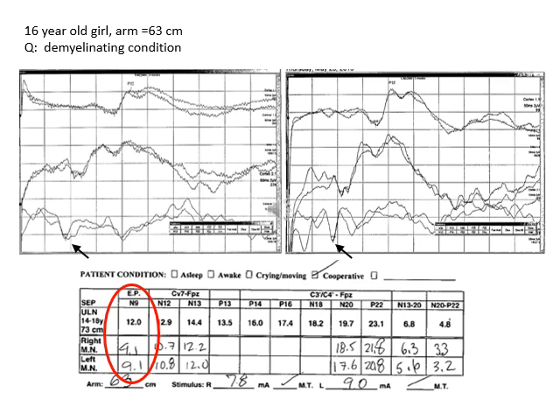And then when we look at the bottom, we'll see that the technologist has written in the latency values, which are 9.1 for both the left and right arms, and the upper limit of normal is 12. So the Erb's point recordings are within normal limits for both arms at this point.